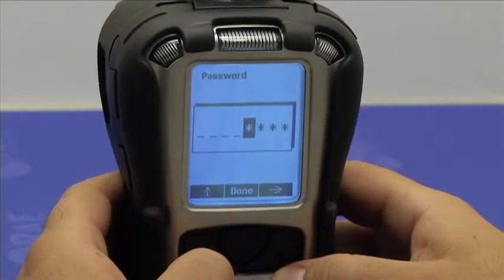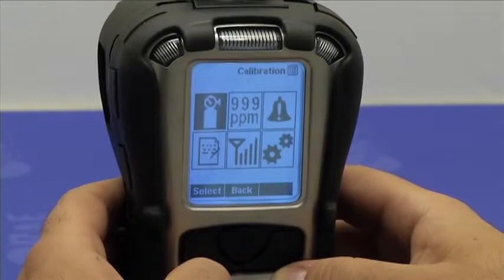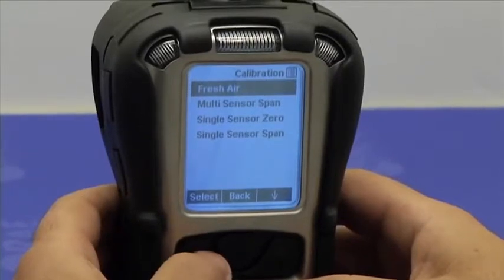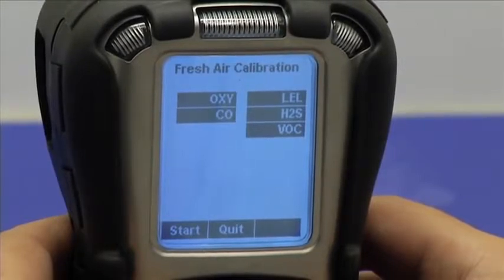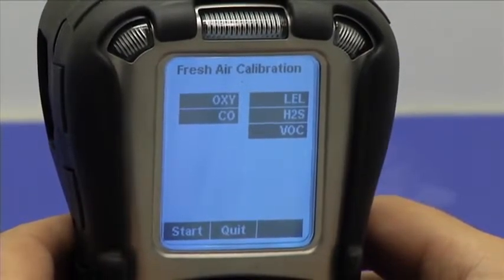If you don't know the password, just press done, and you would still be able to access the basic calibration options. Press the Y button to enter the calibration menu and select fresh air. The instrument shows which sensors are going to be simultaneously calibrated in fresh air. So now all five sensors of interest are selected here.